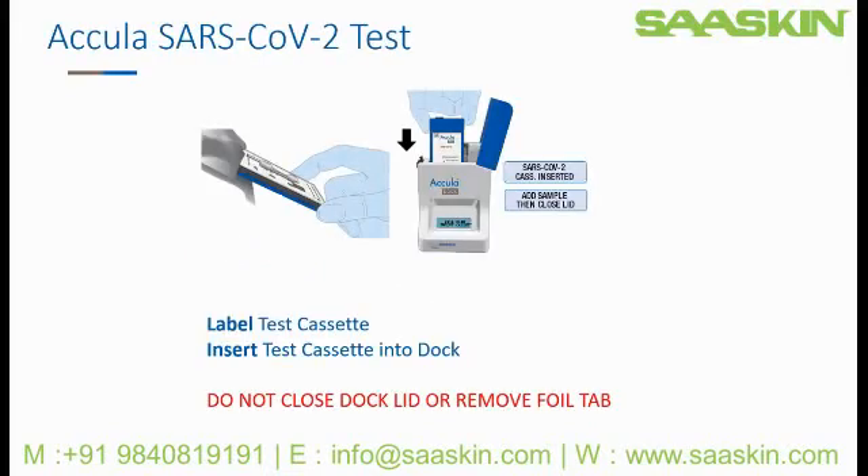Now we'll proceed on learning how to start a test. Remove the test cassette and pipette from the foil pouch. Label with patient name and testing date, and then insert into the dock. The dock will read: SARS-CoV-2 cassette inserted, add sample, then close lid. At this point, do not close the dock lid or remove the foil tab.